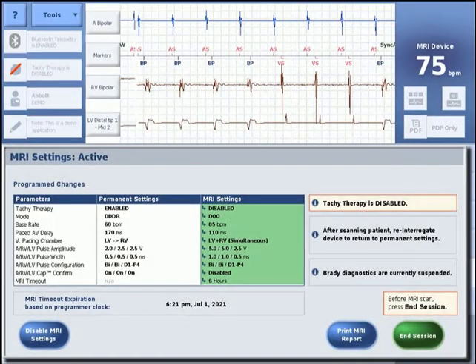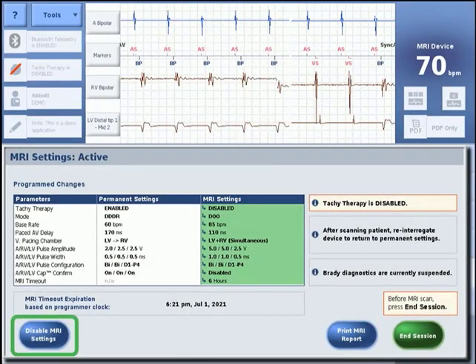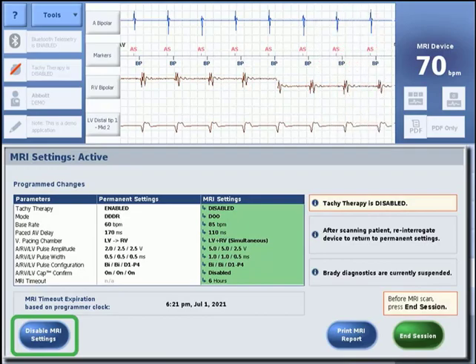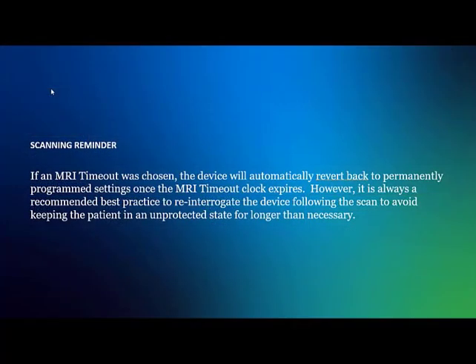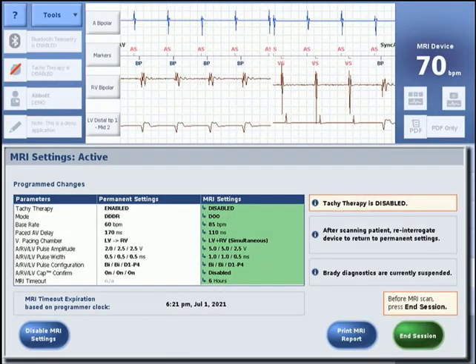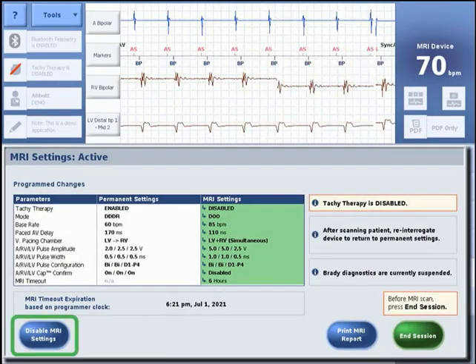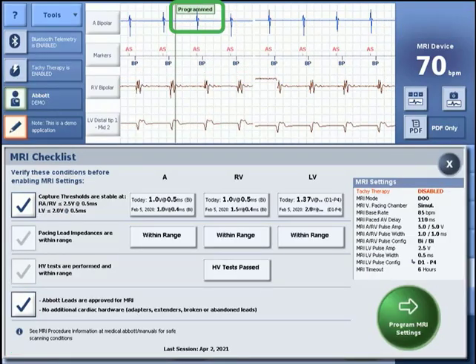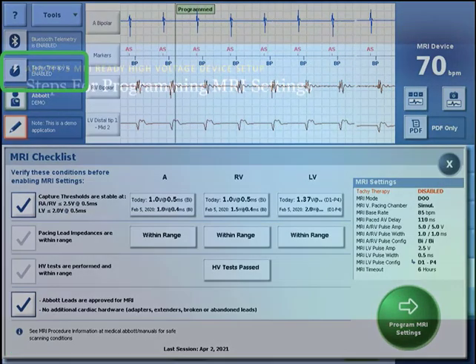As soon as the MRI scan is complete, reinterrogate the device to disable MRI settings and return to permanent settings. If an MRI timeout was chosen, the device will automatically revert back to permanently programmed settings once the MRI timeout clock expires. However, it is always a recommended best practice to reinterrogate the device following the scan to avoid keeping the patient in an unprotected state for longer than necessary. Upon interrogation, the MRI settings active window will be displayed. Press Disable MRI Settings to return the device to the permanent settings and re-enable tachycardia therapy.